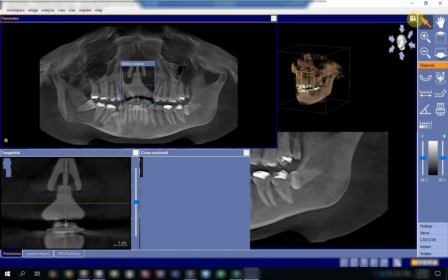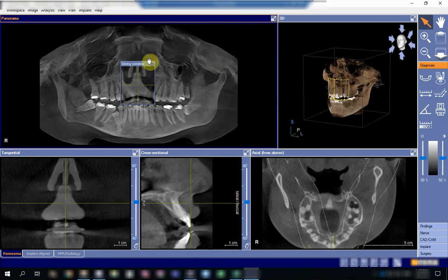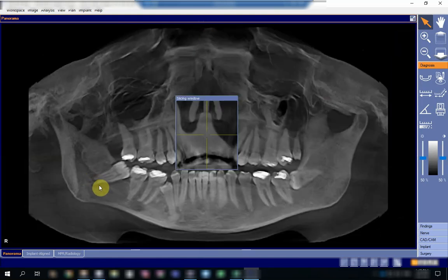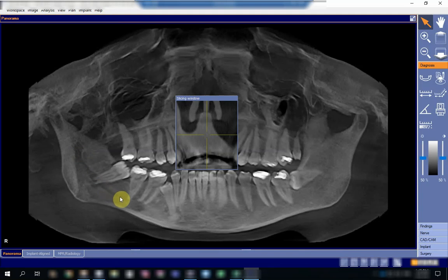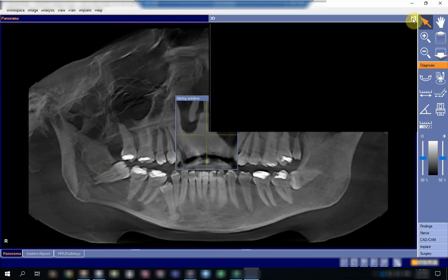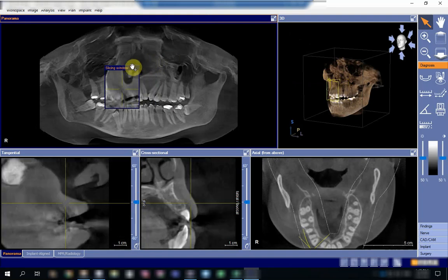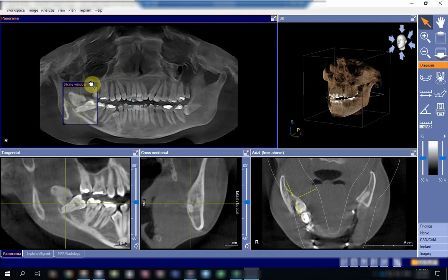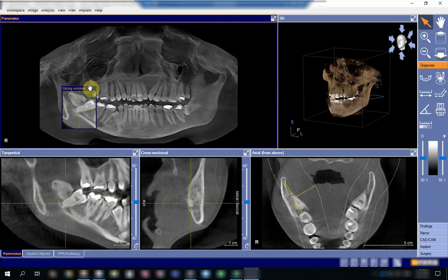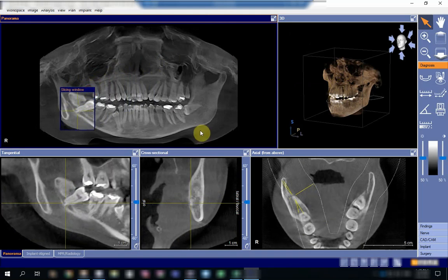Before I go to the verification, I want you to concentrate on this area—you will see that the apex of the tooth is exactly over the canal. This is the course of the canal and this is the apex of the tooth. We will try to bring the slicing window exactly on the apex of the tooth.